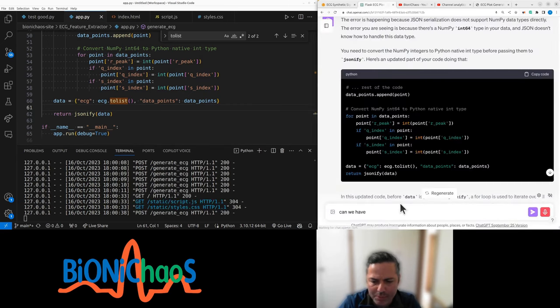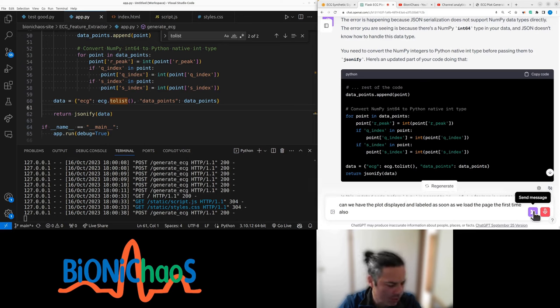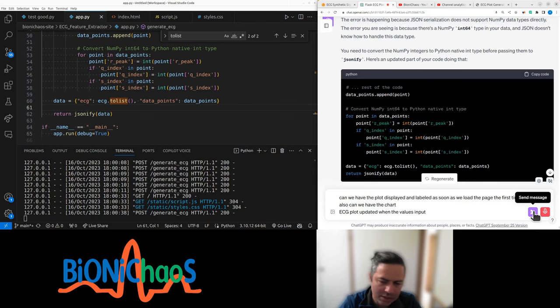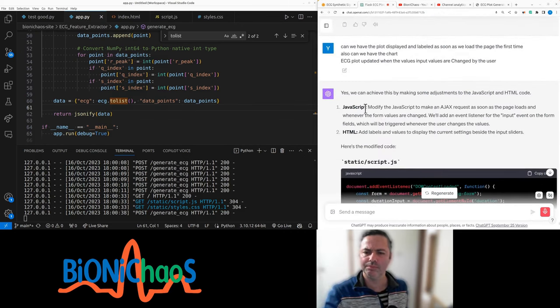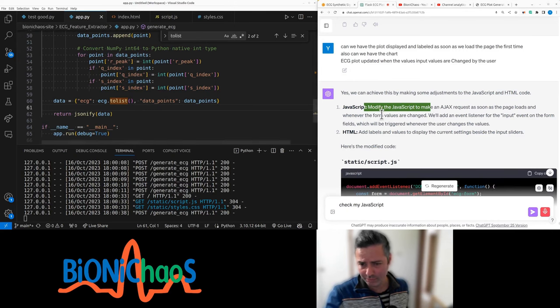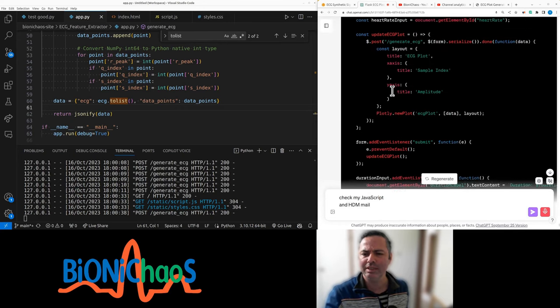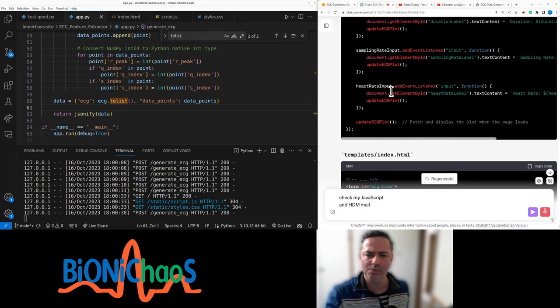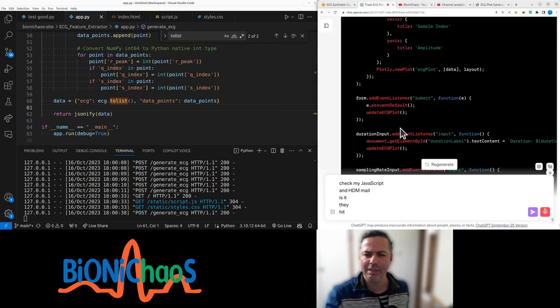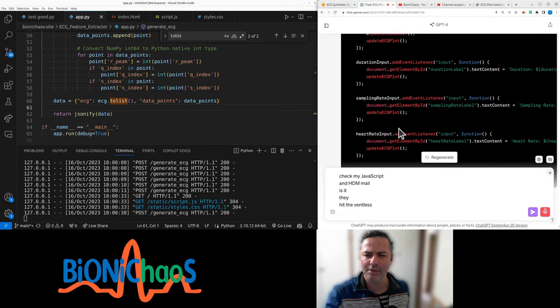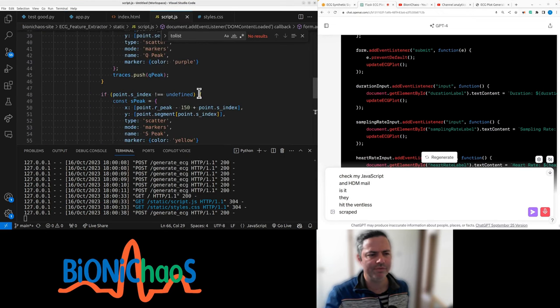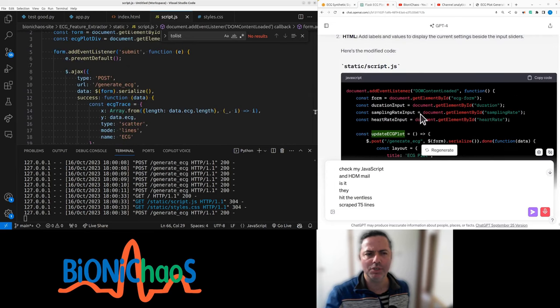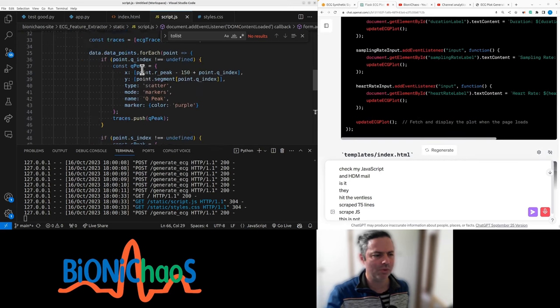Can we have the plot displayed and labeled as soon as we load the page the first time? Also, can we have the chart ECG plot updated when the values, input values, are changed by the user? By modifying the JavaScript and HTML. Is this the whole code? Date addEventListener. JavaScript, 75 lines, script.js. This is not the whole code.